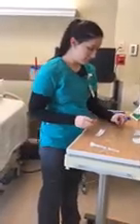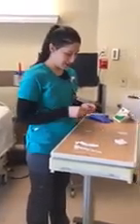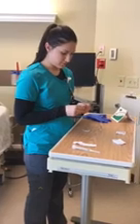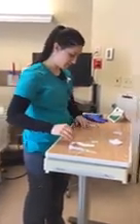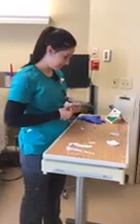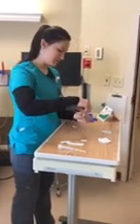Okay, so now that we have that ready, I'm going to go ahead and use this alcohol pad just to use this as my sterile surface. And I'm going to go ahead and take this. I'm going to use this to break the sample.